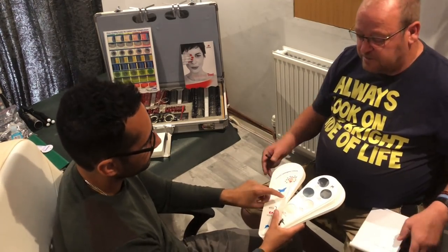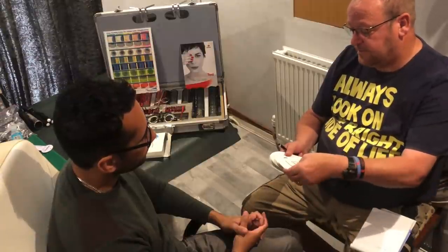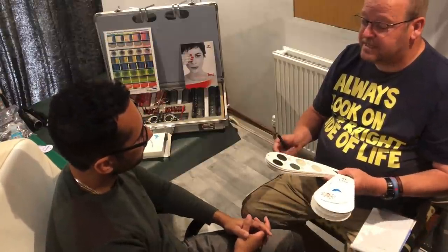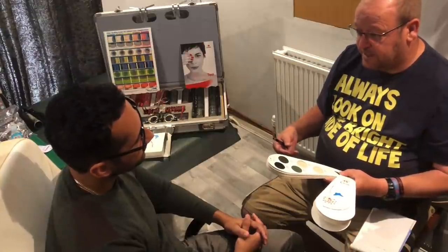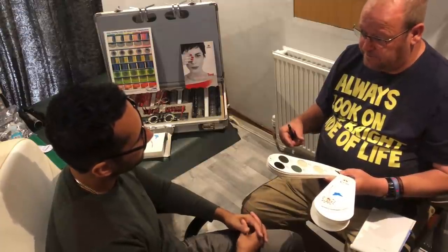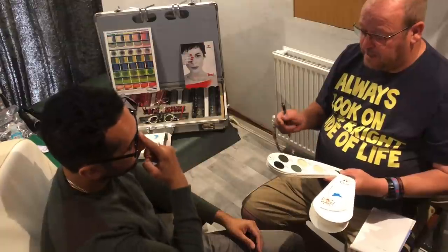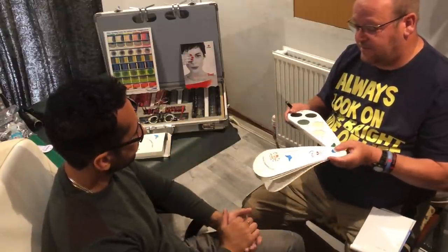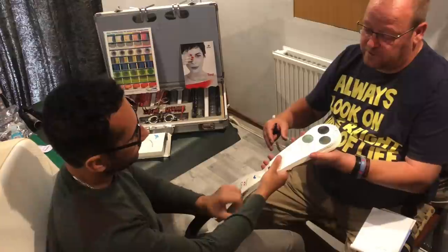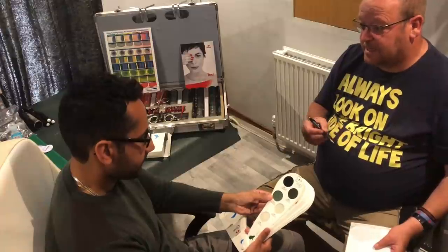Do you have any more? Yeah, I'm going to go through some more colours and I can explain where they benefit you. So as we move on to the next tint, we're now looking at some greens. Now with the green, they still have the same transmission and absorbency rate as the other tints, but the effect is that they don't appear to be as dark when you look through them. A famous green tint is the Ray-Ban G15, and although these aren't the Ray-Ban G15, these are still giving you a good idea as to what the greens can look like.